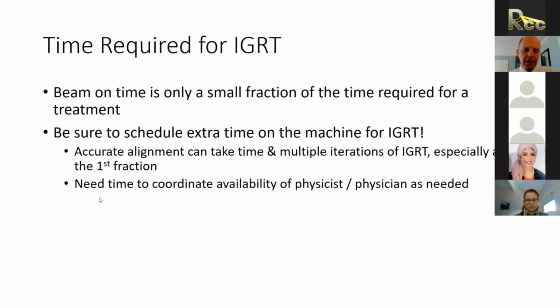And you need time to coordinate availability of physicists and physicians as needed. It may be that the therapists do certain steps and then the physician has to come there, and that can take time as well. So these are all things to be aware of in your schedule. And it's another reason, when you're deciding how to do your image guidance, how to best manage your time on the machine, the benefits to the patient. These are all things to be considered.